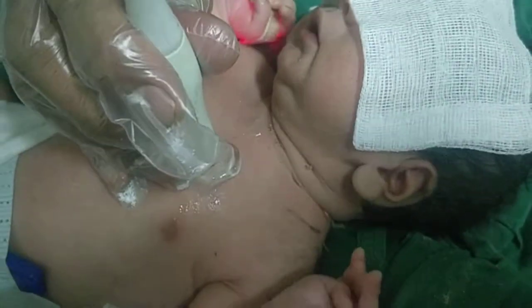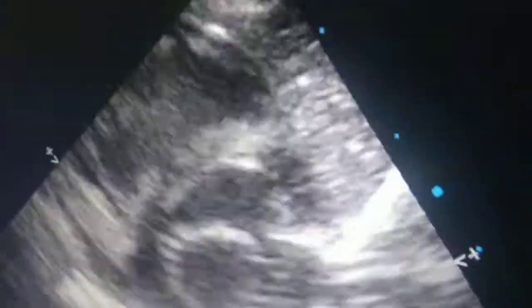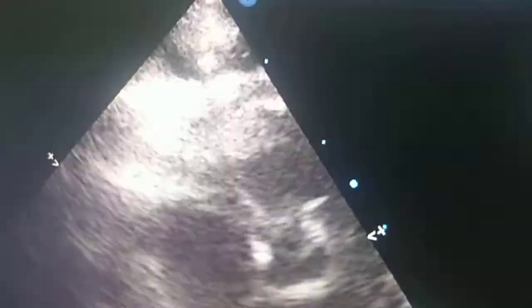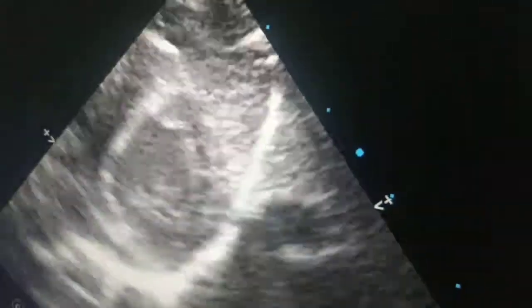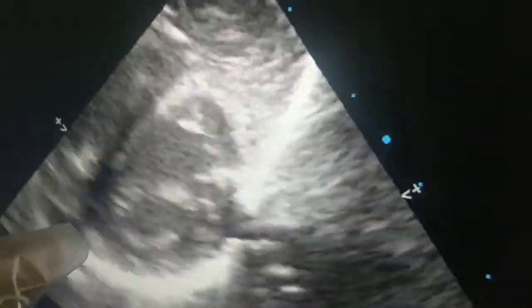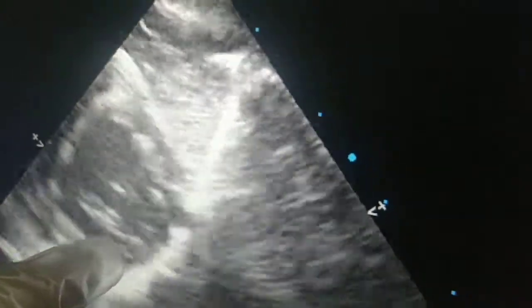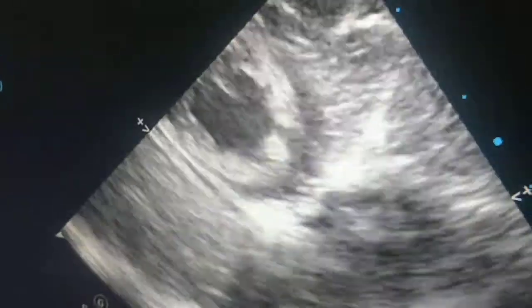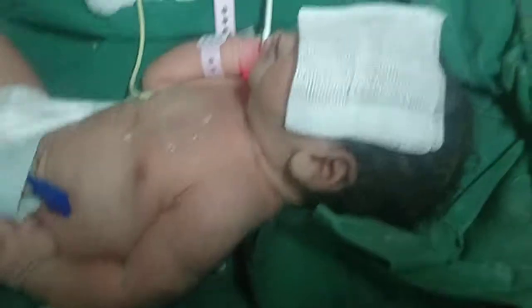I can now demonstrate the short axis mitral view: you can see the fish-mouth appearance of the mitral valve, the right ventricle, and the interventricular septum. Tilting further, I get the short axis papillary view where you can see the papillary muscles. Tilting still further, you can see the apex of the left ventricle. These are the four important short axis views: great vessel view, mitral view, papillary view, and apex of the left ventricle.